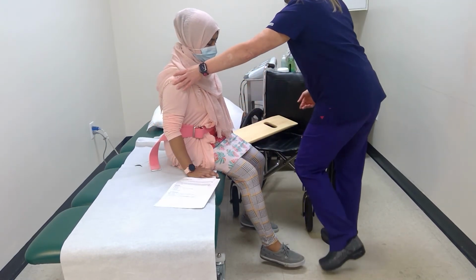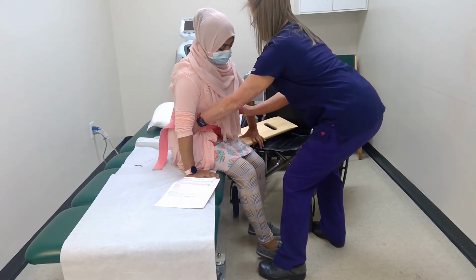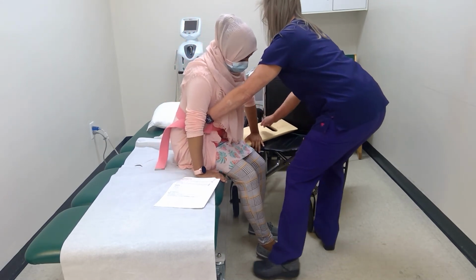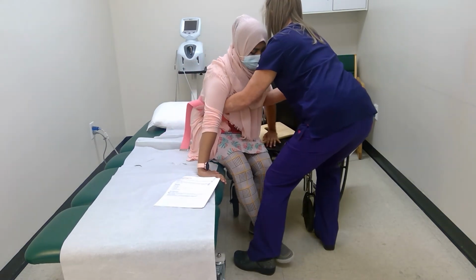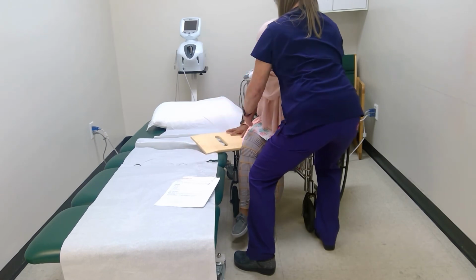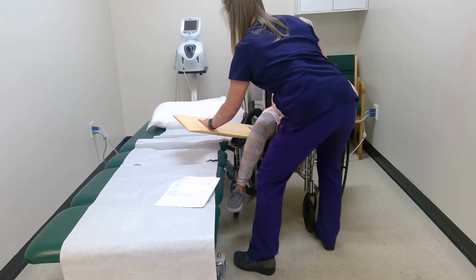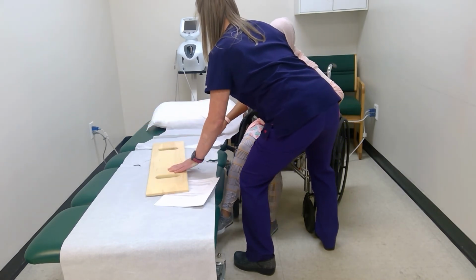And I'm going to make a bridge to the wheelchair. Then I'm going to have you lean towards me and we're going to scoot onto the bridge to the wheelchair. Very good. You did a good job. Then she can lean up and I'm going to take the sliding board out.